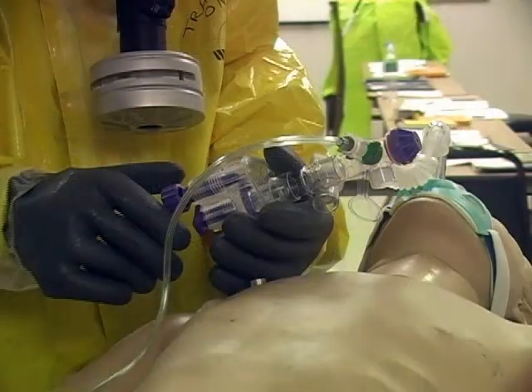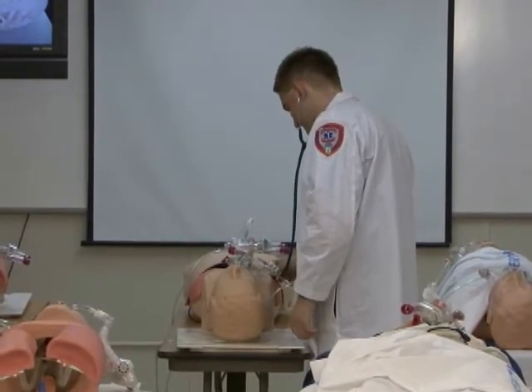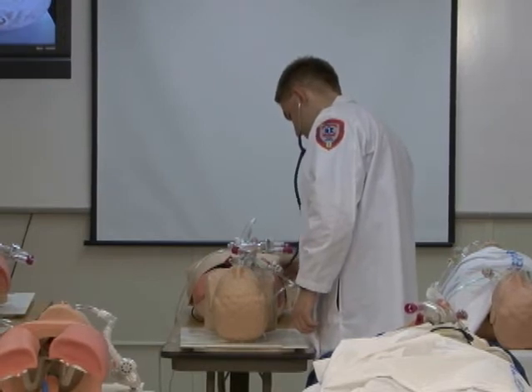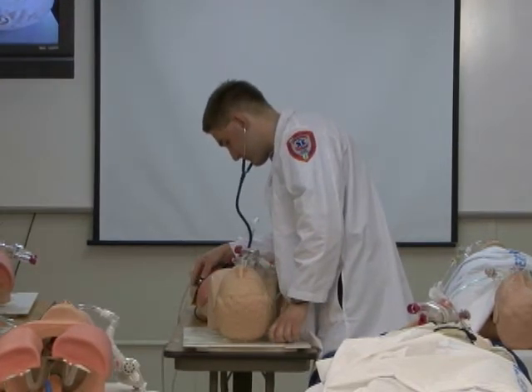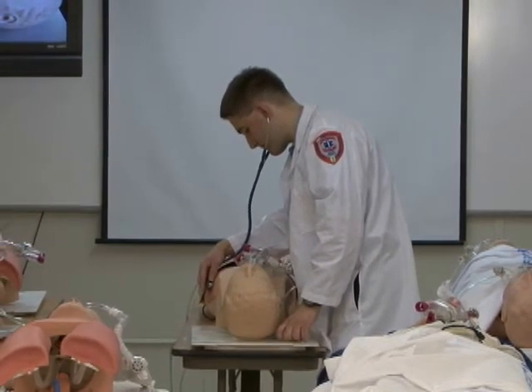If the patient is breathing spontaneously but needs support, put the resuscitator in the pressure support mode, in which the patient triggers a breath. This is accomplished by adjusting the rate dial clockwise just until the resuscitator stops cycling automatically. Be sure to monitor the patient's effort with a manometer. Because the automatic resuscitator has no monitoring functions, it is imperative that a clinician be present at all times. Observe the patient to ensure proper ventilation and do not leave the patient unattended.